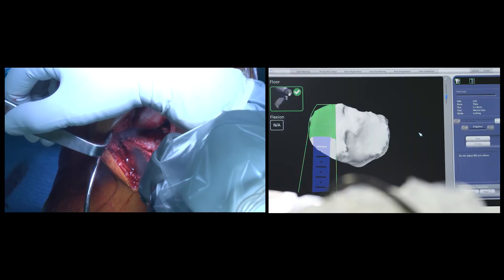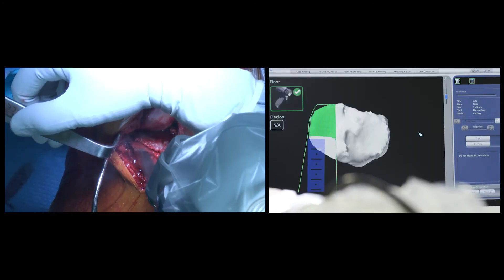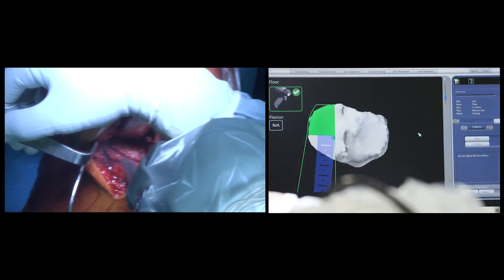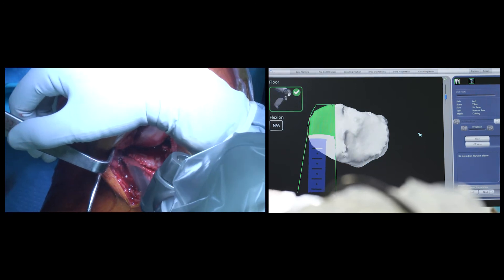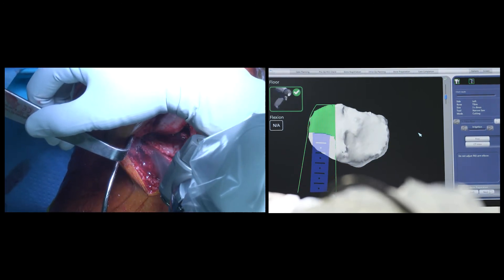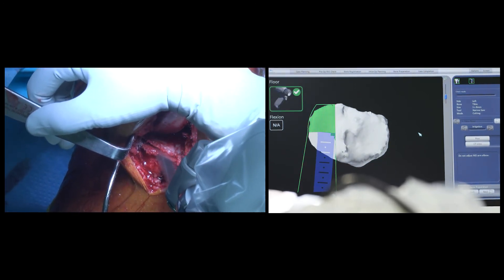Once I'm happy with all the above parameters, the robotic arm and saw are brought in, and the bony cuts are performed.